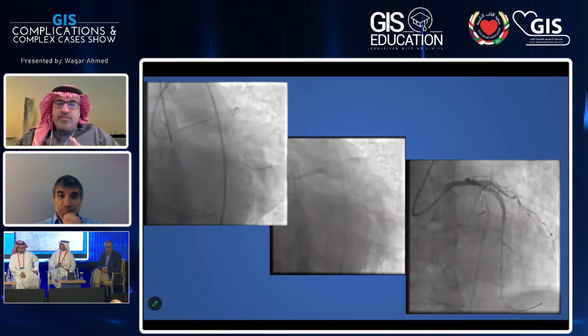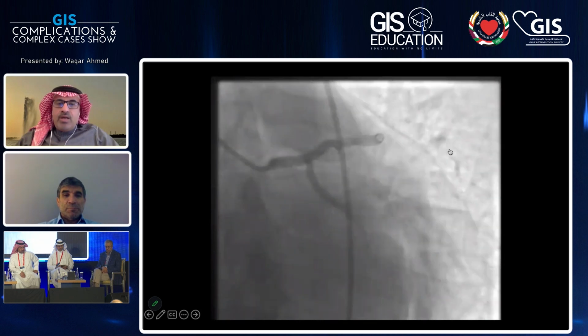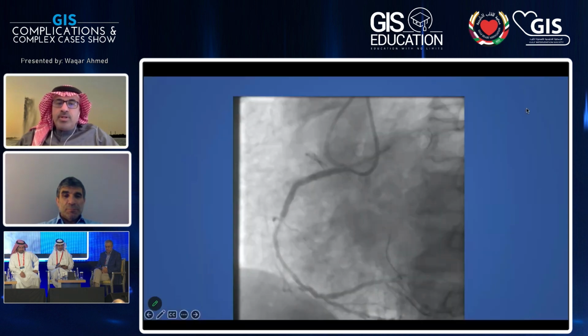We had the safety wire, so immediately stented it, ballooned it. We had the IVUS on the table. All that was fixed. And that took care of this vessel, and the patient's hemodynamics improved. And we were able to complete the RCA CTO, which was almost done by that time.